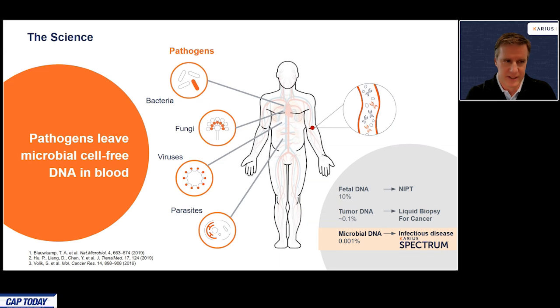found in plasma. And this approach is based on the observation that the microbes throughout our body, and particularly those causing infectious disease, they don't live forever. They turn over, and when they do, they release fragments of their unique genome into the bloodstream to be recycled or excreted like all the other nutrients and waste in our body.